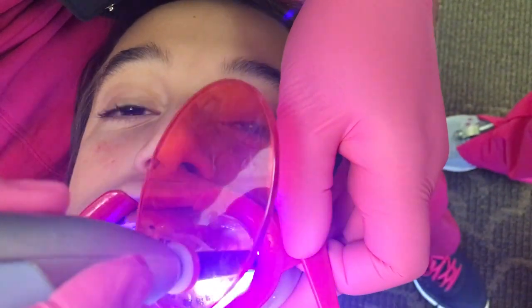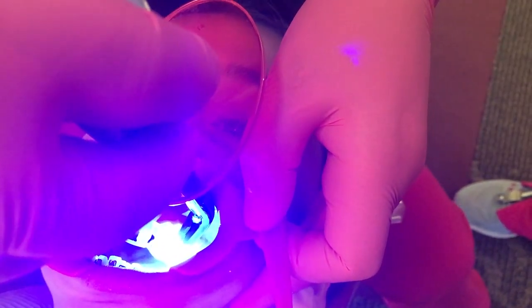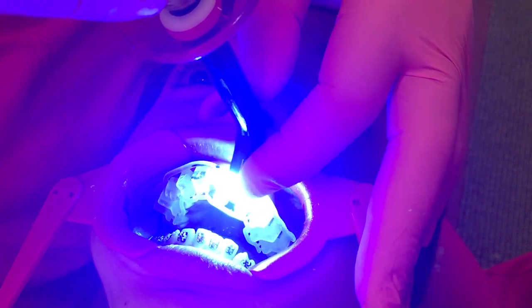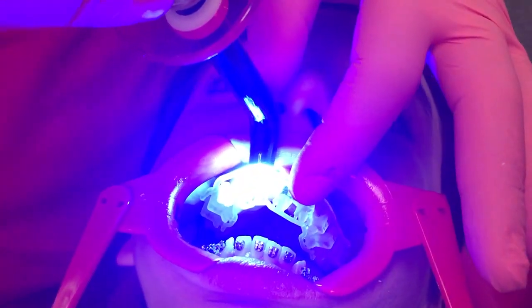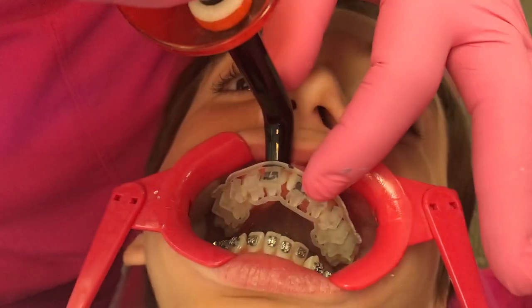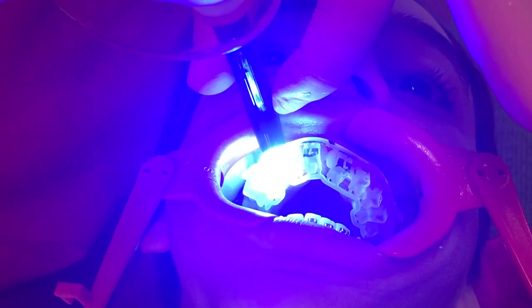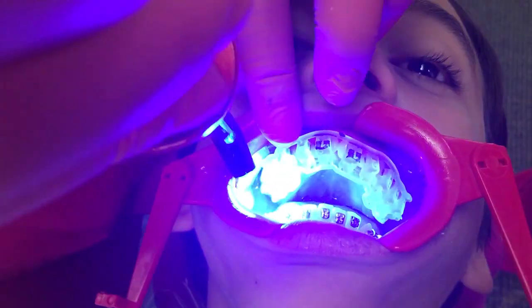Stretch a little bit. Exactly. Make sure you stretch a tiny bit in there, and make sure your light goes up into the jig. Perfect. Good job, Seri, sorry about the stretching, girl. Good job. Good job. Good job.